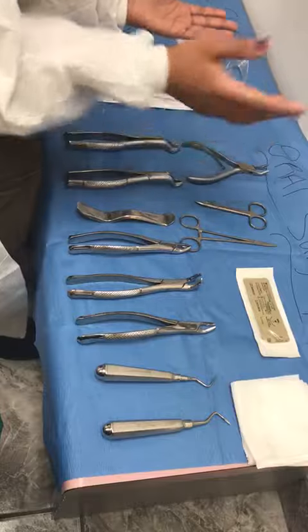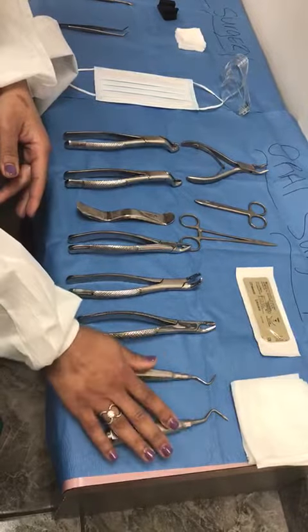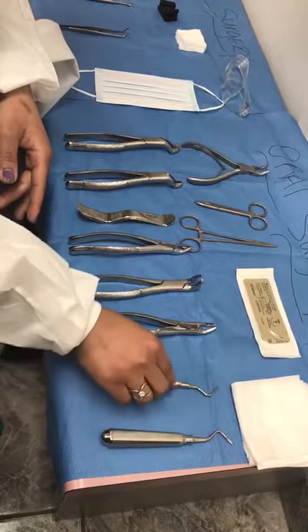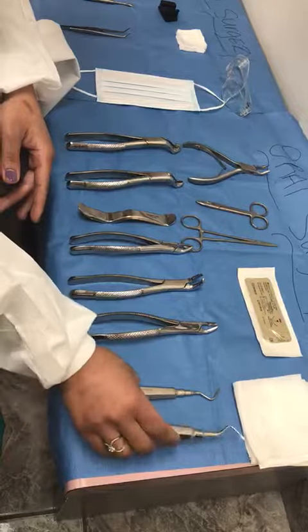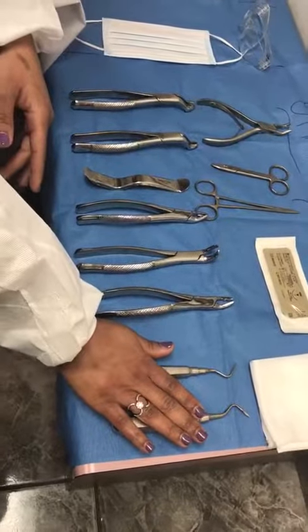This is a root tip pick. We have two root tip picks — one is for the right side and one is for the left. They go east and west, really — they're going east and west. These root tip picks are used to remove roots of the tooth.